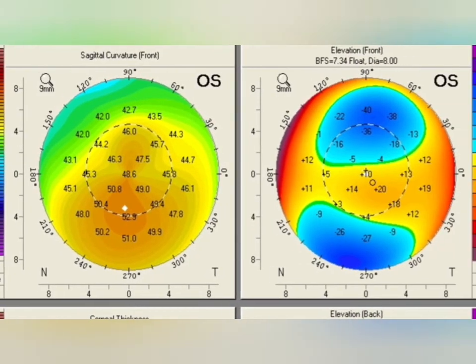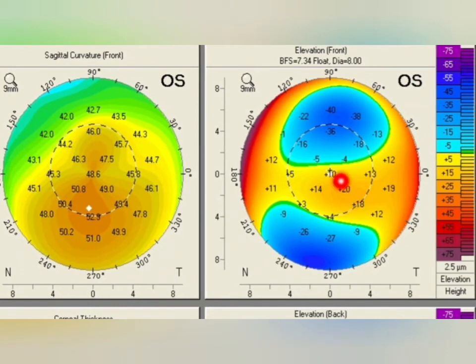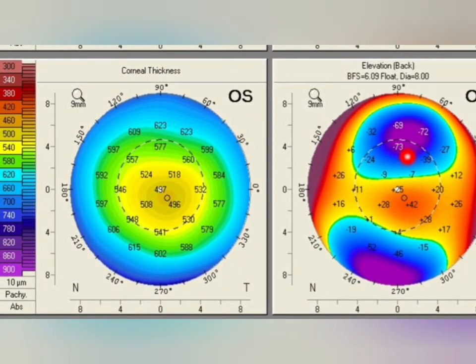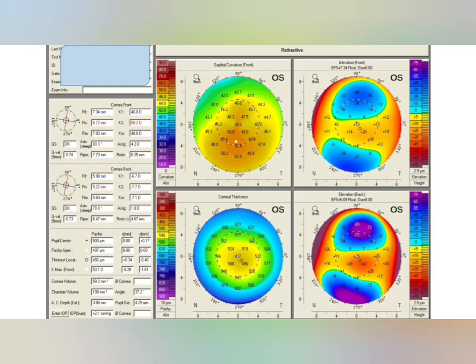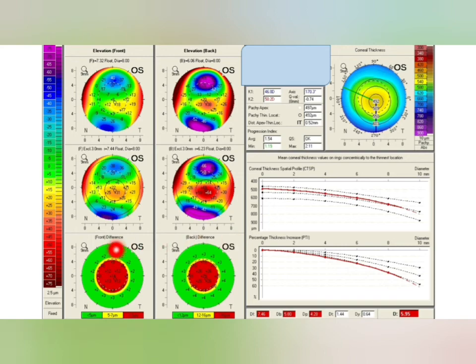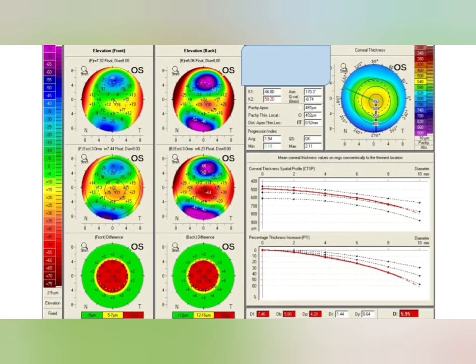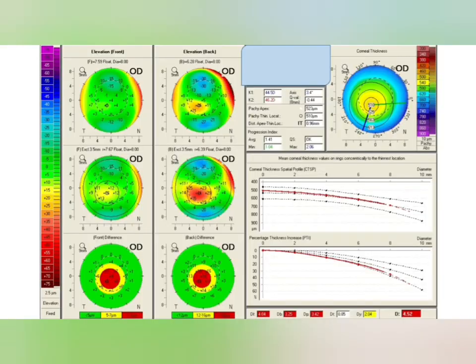In elevation front the thinnest point corresponding value is plus 20 — more than plus 8 — absolutely abnormal. The elevation back shows values like plus 28 or minus 73, all abnormal. Corneal thickness at the thinnest local is 497 — in normal range — but other parameters like elevation front and back, sagittal curvature, and Kmx all indicate an ectatic condition. In the Belin-Ambrósio map it is clearly indicating keratoconus: the red line deviates before 2mm, the average value is 1.54, and the D value is 5.95 — all abnormal — confirming keratoconus.